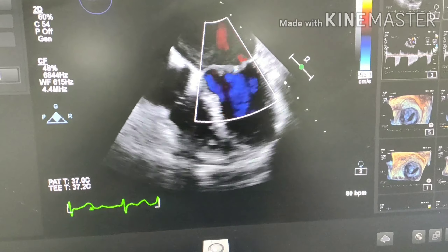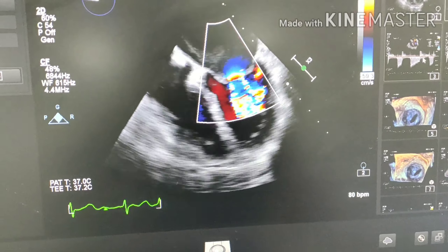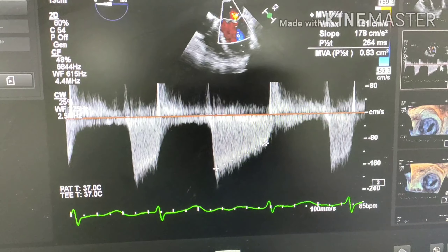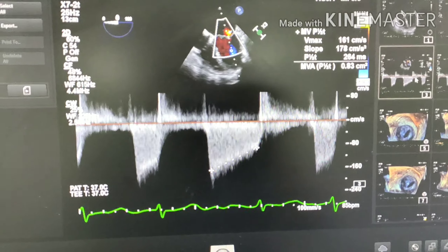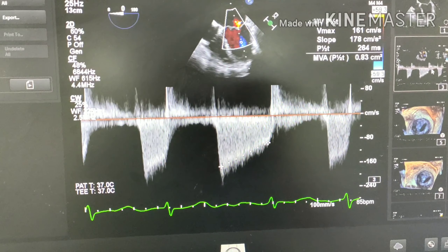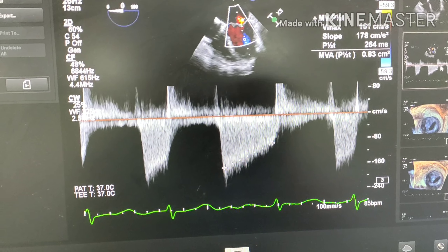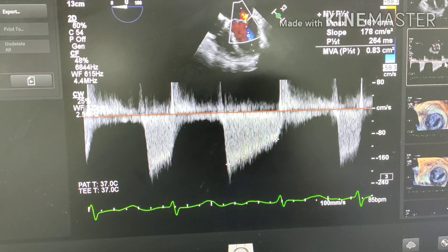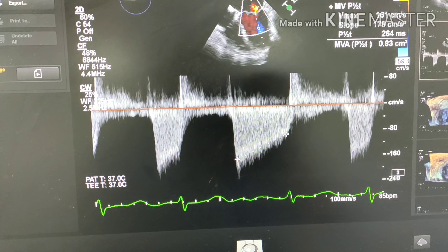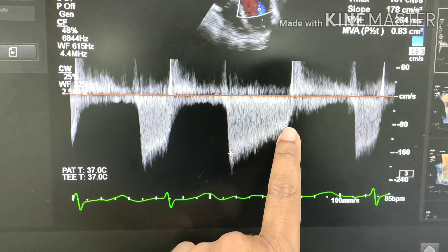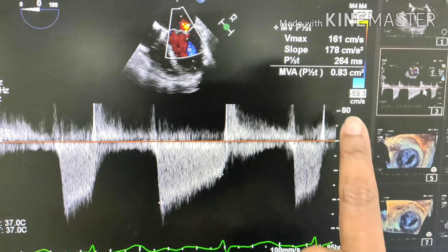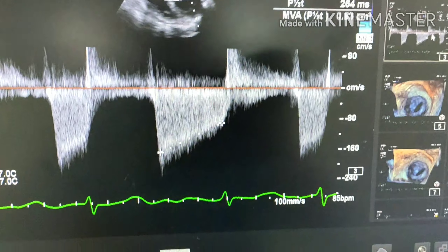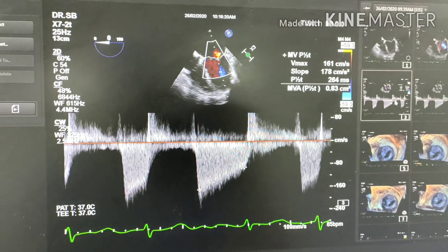Now we want to quantify the exact degree of mitral stenosis. One of the ways of doing it is to use the pressure half-time method. You put a continuous wave Doppler on the mitral valve and freeze the Doppler profile. Using the pressure half-time slope, the patient has a mitral valve area of 0.8 cm², which is severe mitral stenosis.